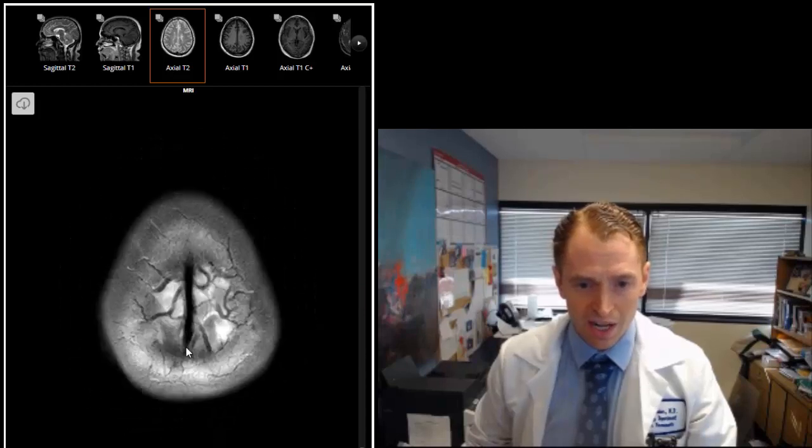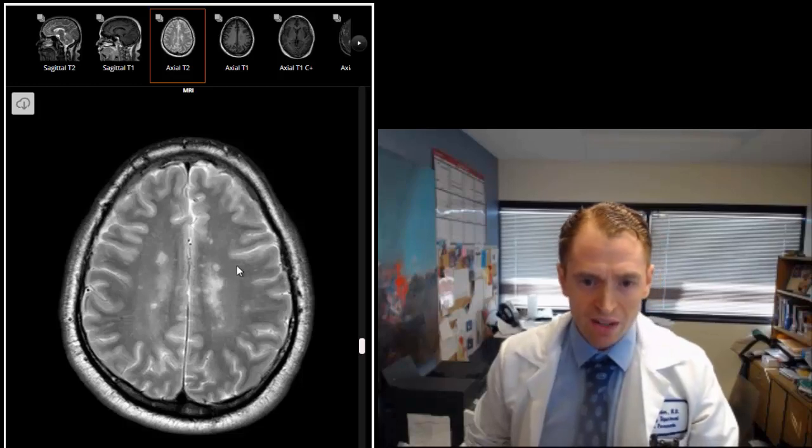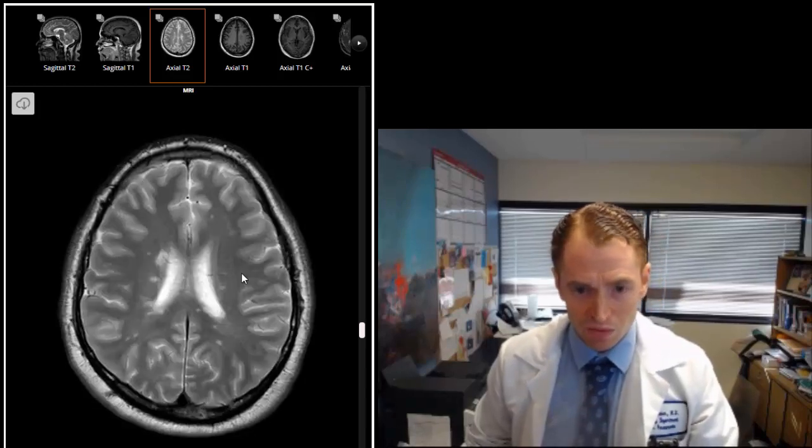This is the superior sagittal sinus, one of the major veins in the brain. And you can see these white matter lesions which are highly consistent with multiple sclerosis.